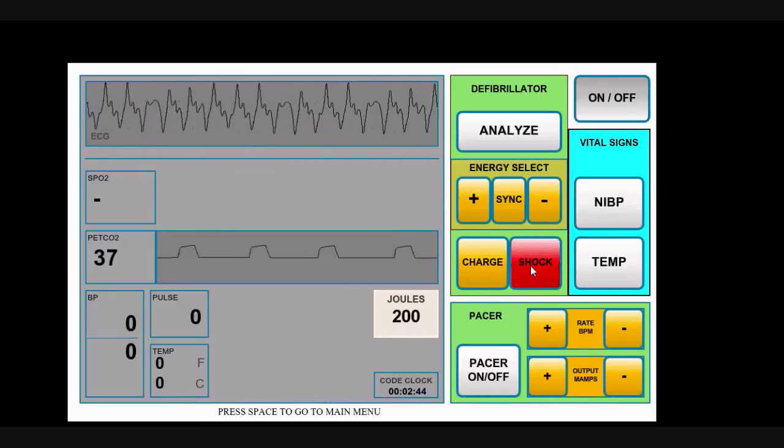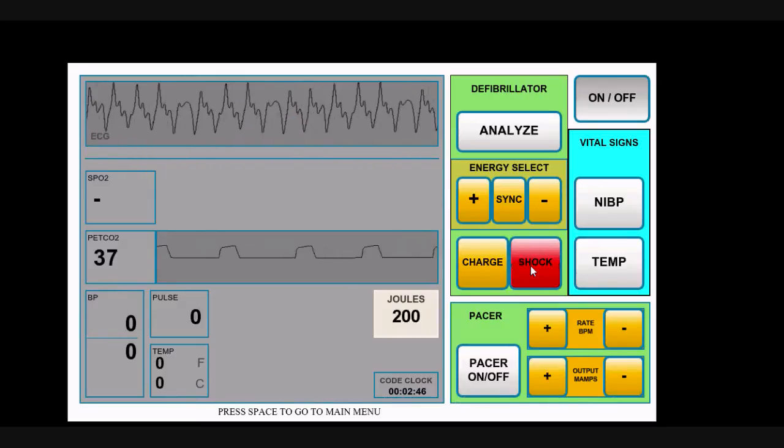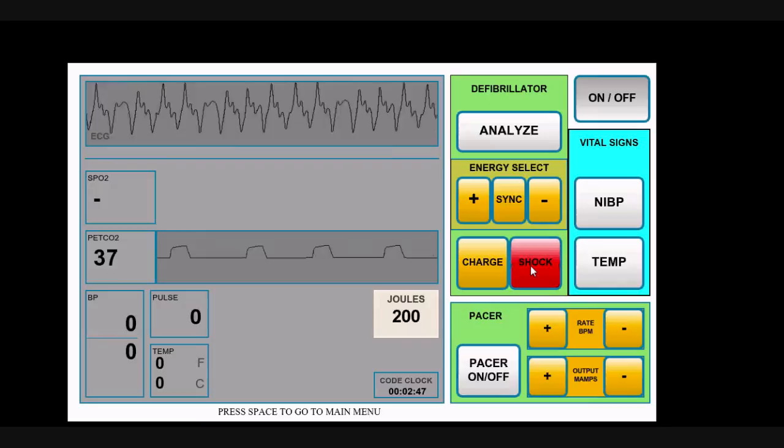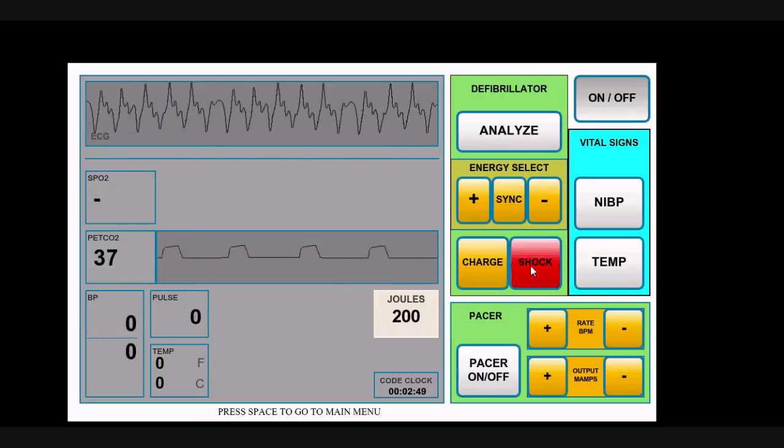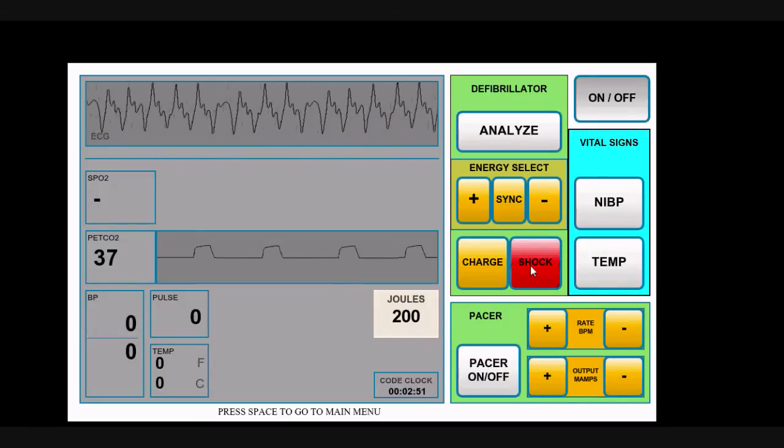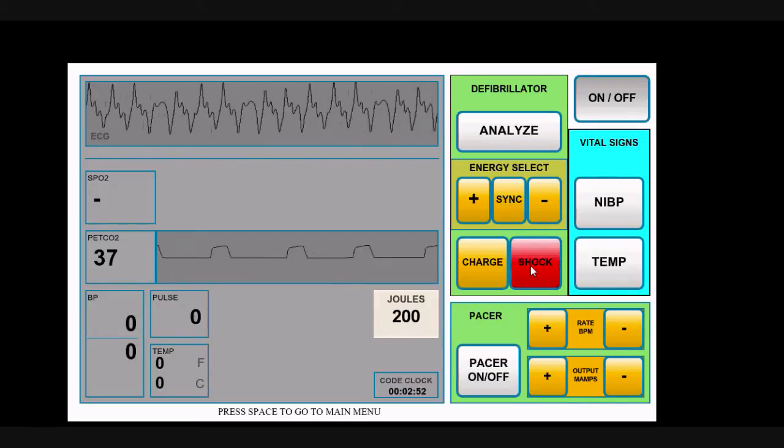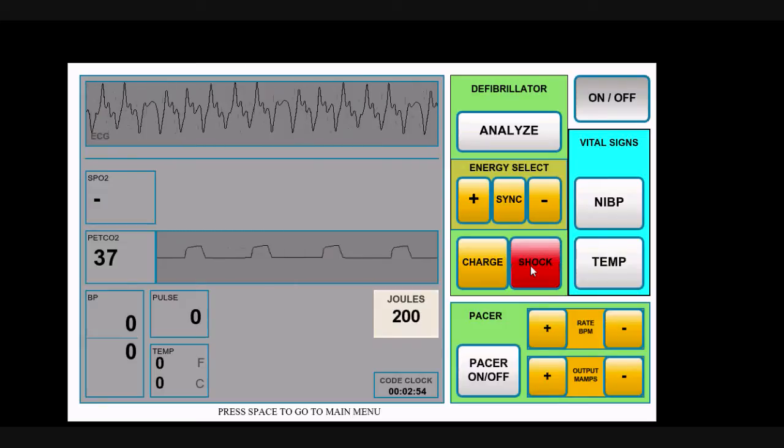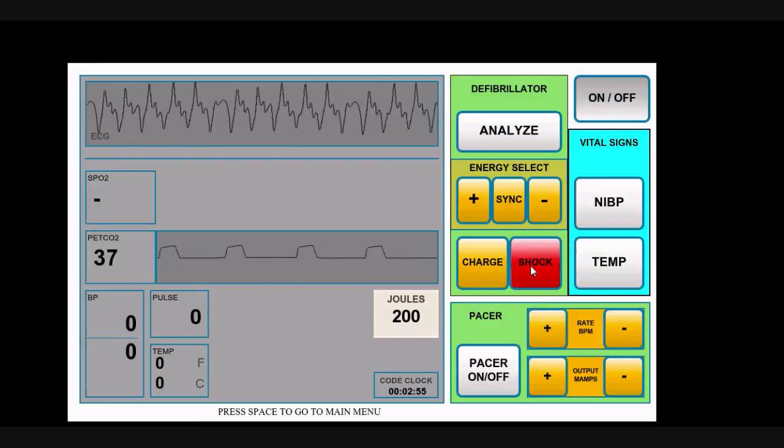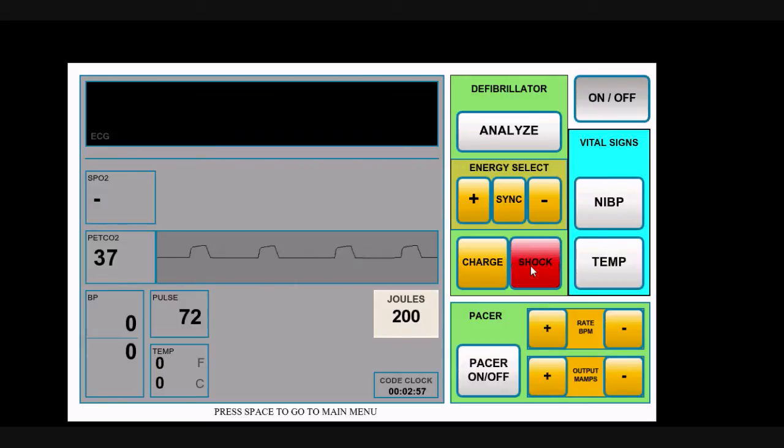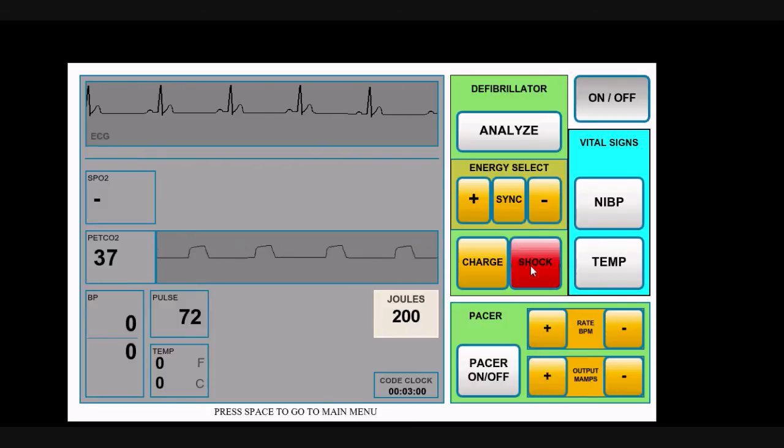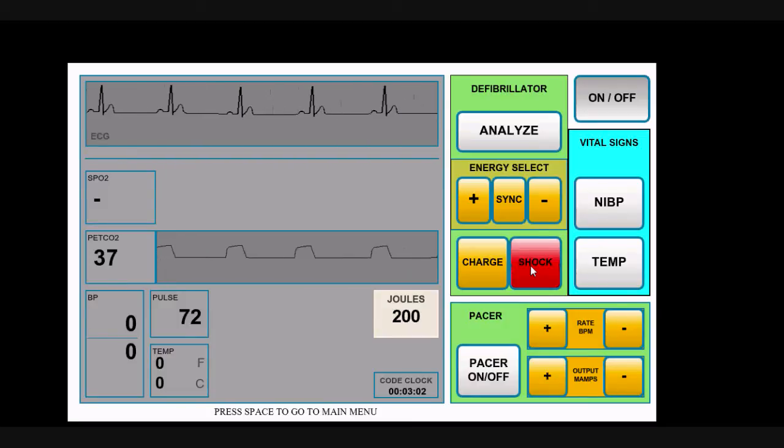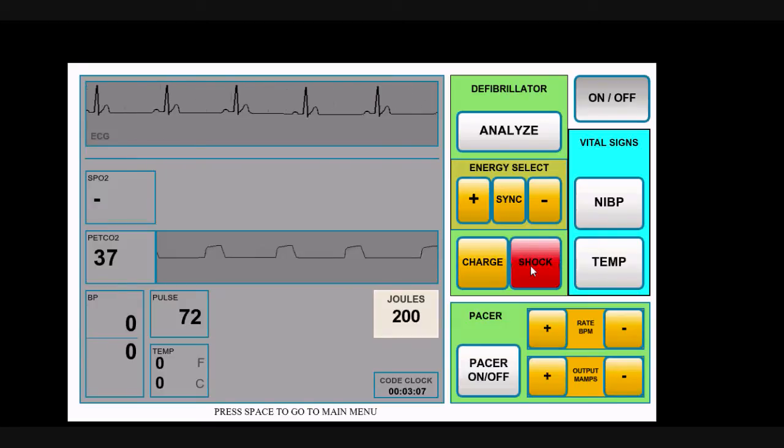One of the most pleasant surprises when you're training a group that's never used CO2 detection before is when you give them an abrupt increase in CO2 and the light bulb goes off and the student immediately stops CPR. You can hit the number one key to reveal the underlying rhythm below the chest compressions. This student has recovered. He's doing much better.